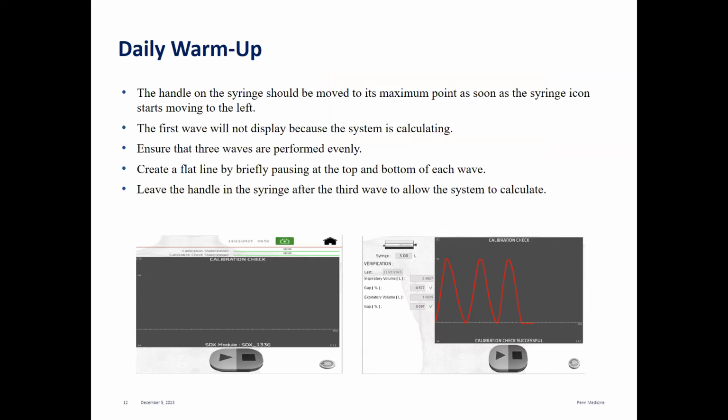The handle on the syringe should be moved out as soon as the syringe icon appears and it starts moving to the left. The first wave will not display because the system is still calculating.